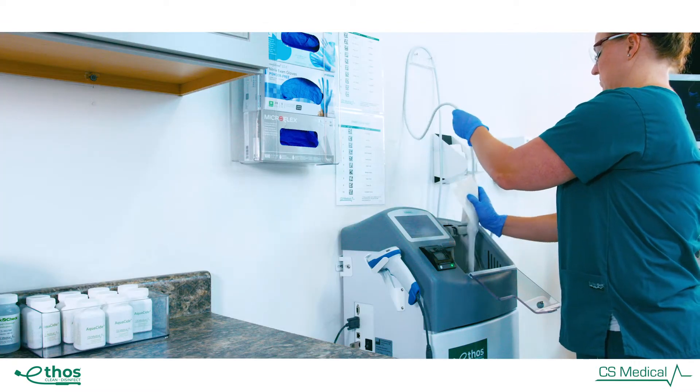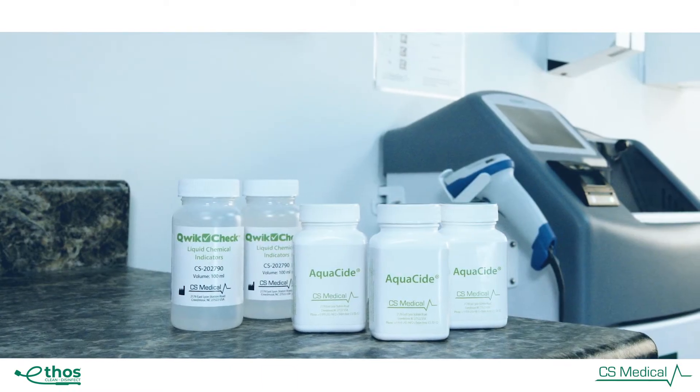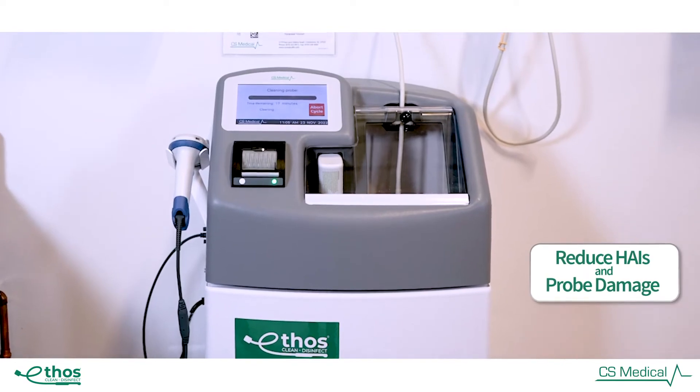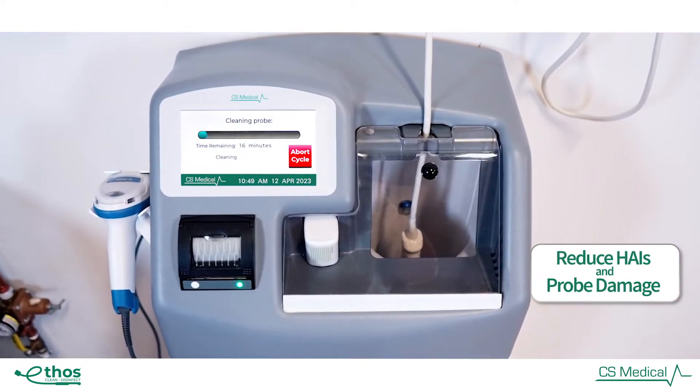Ethos is setting the standard for what an ultrasound cleaner and disinfector should be. Through automation, Ethos is continuing the fight against the spread of healthcare-associated infections while also providing a significant reduction in probe damage.